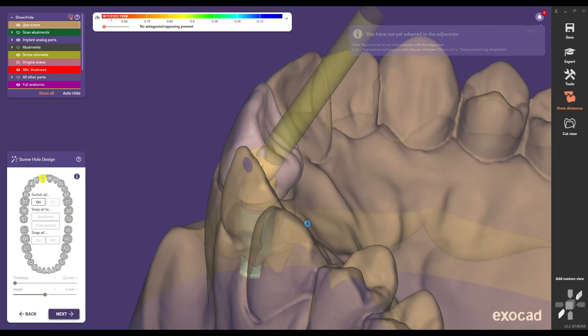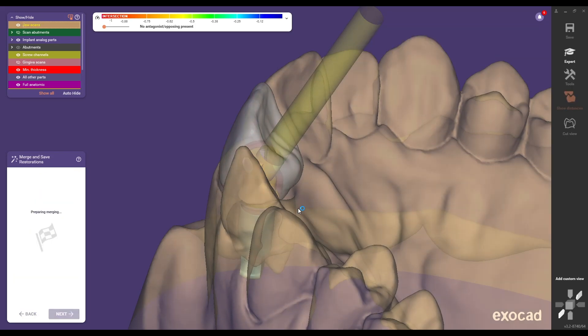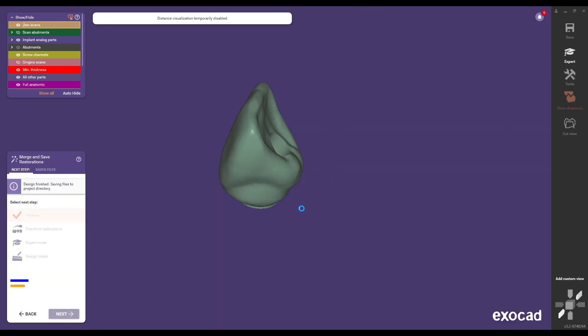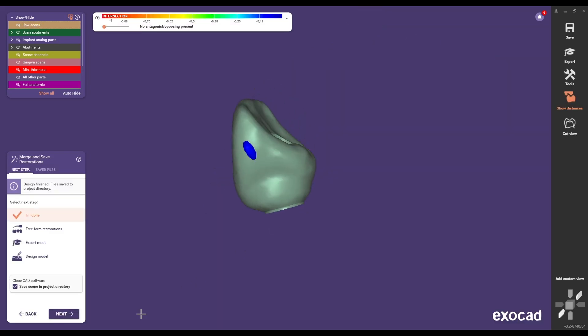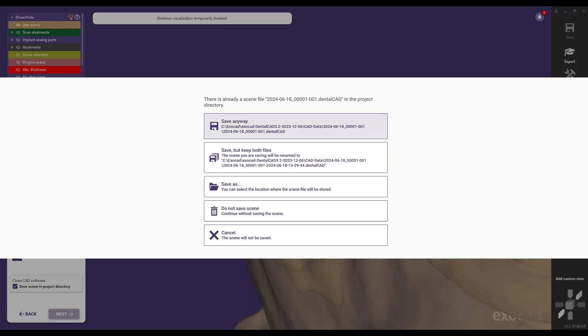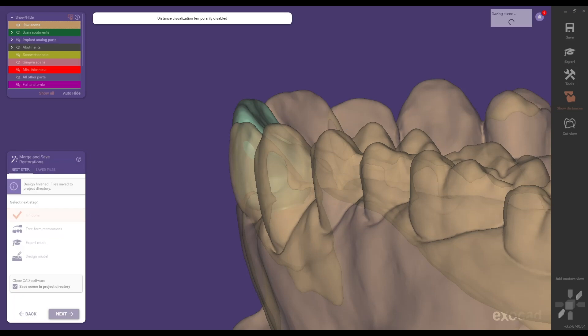By following these steps you can efficiently create high quality restorations on the titanium base ASC Flex. This process enhances your laboratory's digital capabilities making it easier to achieve precise and reliable restorations. With the Medentica library you can optimize your workflow and significantly improve the quality of your dental restorations.